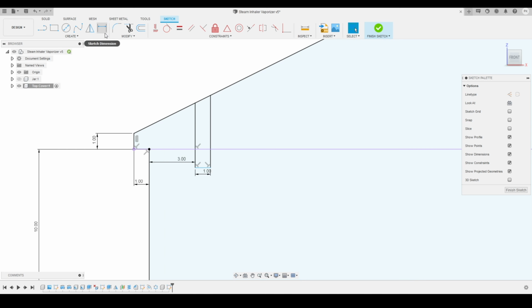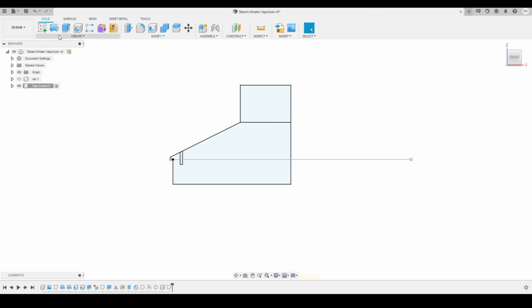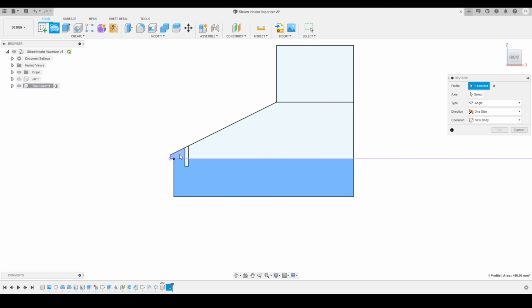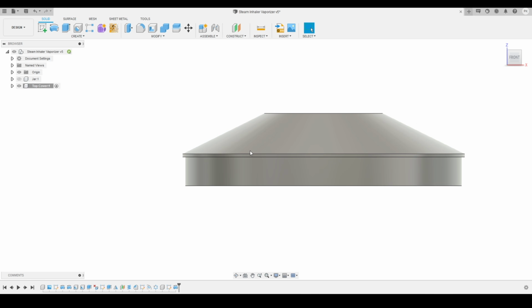Here you can see I have just finished the sketch, and we'll click on finish sketch, and this is the profile we got. We'll activate the revolve tool, we'll select these profiles, and we'll make sure that we have selected all the profiles, and we'll activate the axis. We'll select this axis for the revolve, and we'll press OK. Here you can see this is the profile we got.